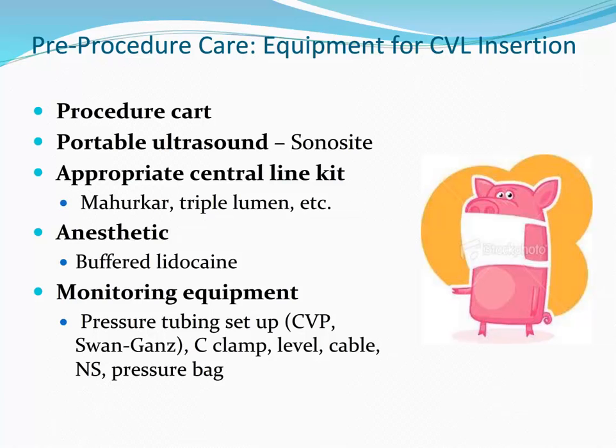Then consider lidocaine and monitoring equipment. Double check with your proceduralist to see what they want for anesthetics. Most will ask for 1% buffered lidocaine in a 2 ml vial. Then gather your monitoring equipment if needed.